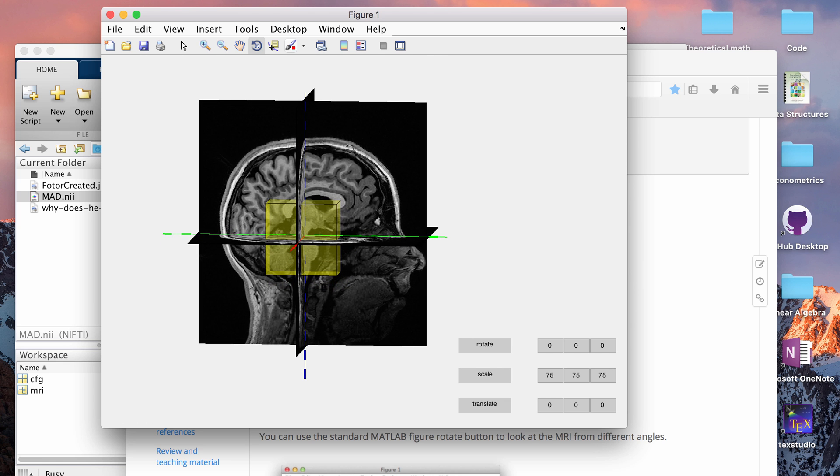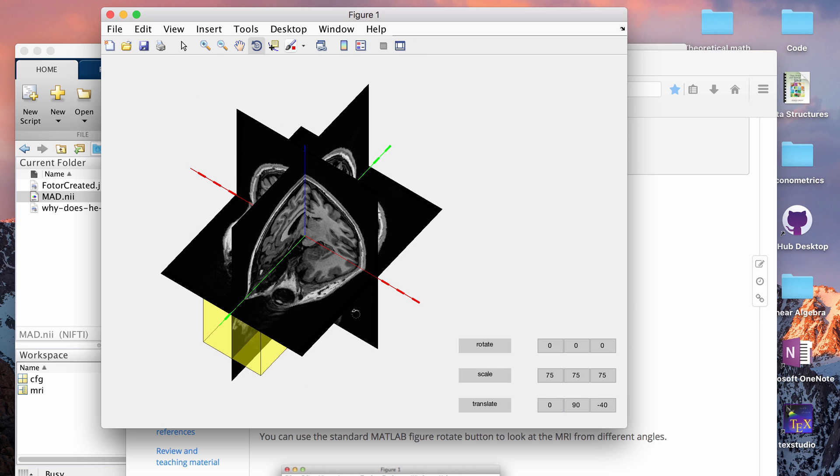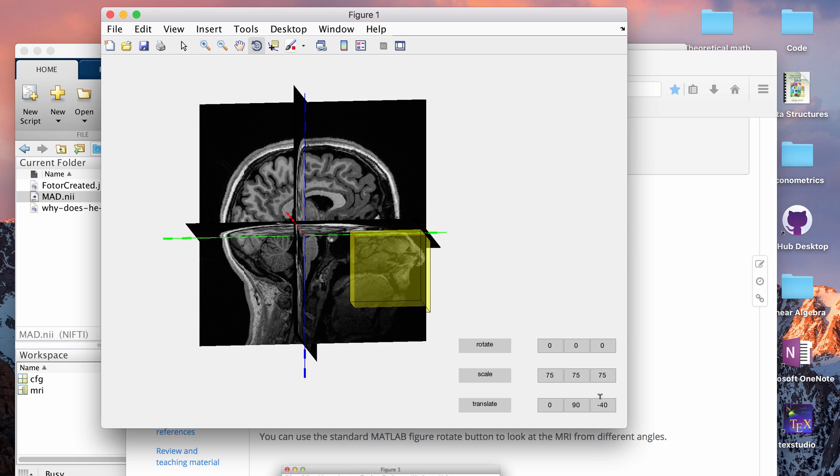And you're going to change or move the box using these little buttons down here. So you can rotate the box on any of its three axes. You can scale it to be larger or smaller and you move it using translate. So I'm going to try to move it to this lower right hand corner. So I'm going to just play around with the numbers and you can do negative as well. So negative will move it down. I think I want it more to the right and you want to try to get some of the eyes if possible.